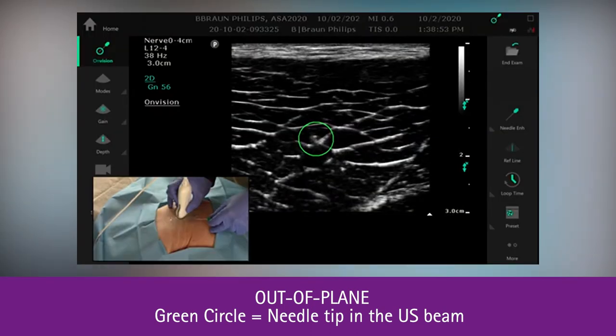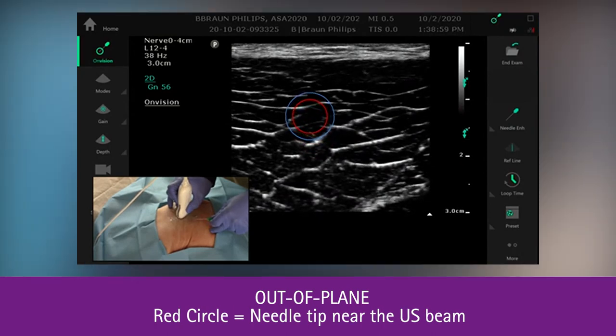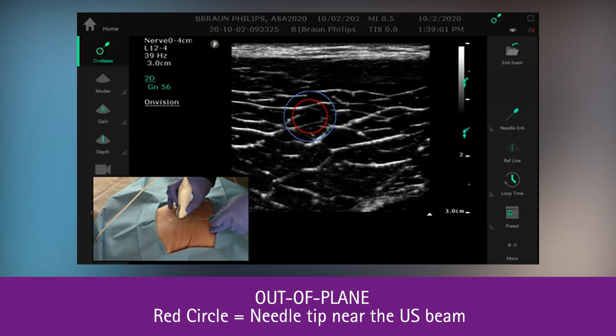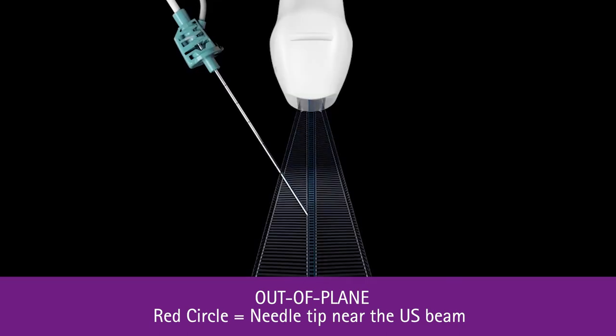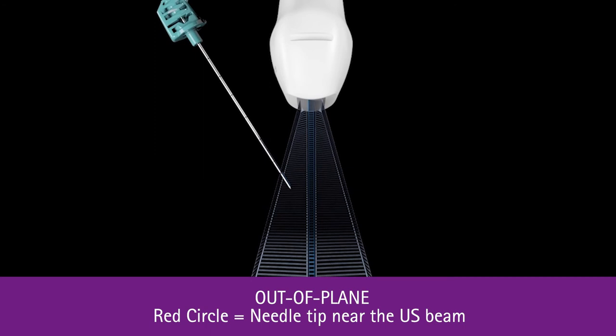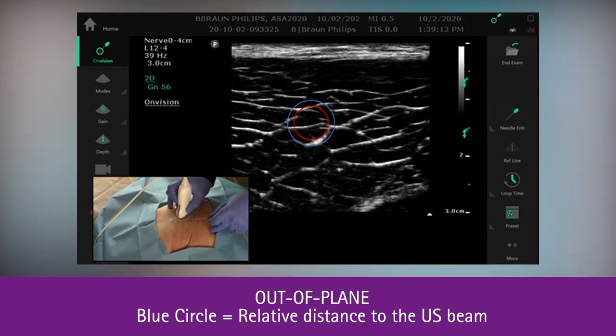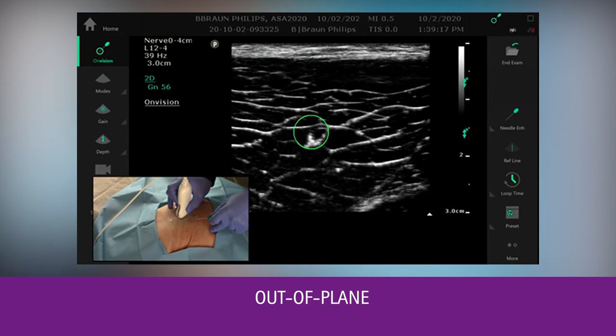We also have the ability to retract the needle and identify that the needle tip is being retracted. You can see we're in the OnVision zone, we're not under the ultrasound plane, and the blue circle is expanding around the red. And as we advance the needle, we will be able to come under and into the ultrasound plane.